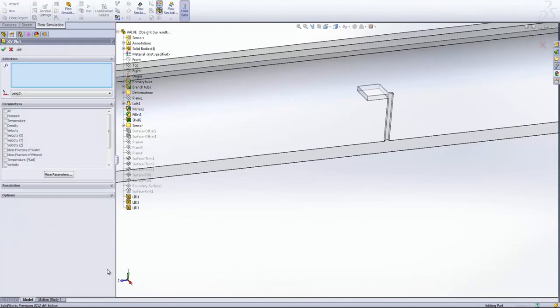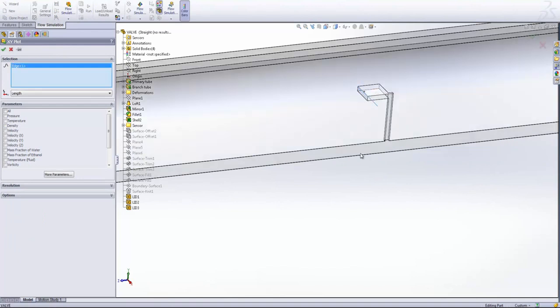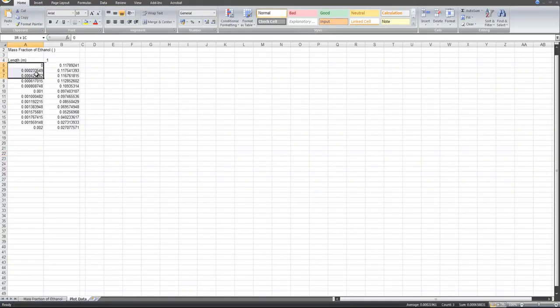Finally, before we go and have a look at some perhaps potential improvements in design, we're going to come in and have a look at using the XY plot tool. And what this allows us to do is, for example, I'm just going to grab an edge there, so I haven't had to sketch anything. By all means you can include a sketch after the solve as well, and I'm just going to use that edge to analyse the mass fraction of ethanol, and I'm going to hit OK. And what the system's going to do now is take the results for a number of nodes that it spans across that edge and output the mass fraction value of ethanol at each of those nodes to Excel, where we get a nice graph showing the variation across that edge, and also we get the numerical values of distance along the edge and the mass fraction of ethanol.